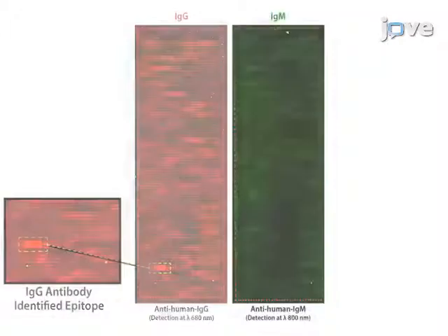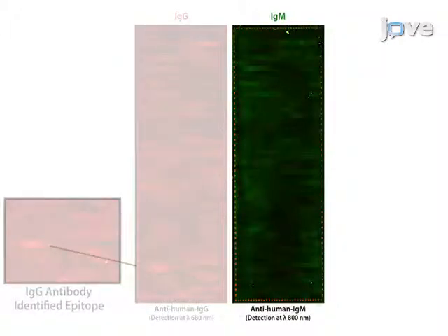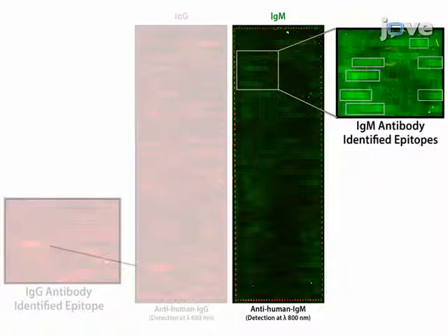Similarly, shown here is a raw fluorescence image of staining the microarray with anti-human IgM after incubating with a specific Zika virus serum sample diluted 1 to 250. Again, the HA-control peptides frame the microarray. Peptides that react strongly to IgM are shown in the zoom panel.